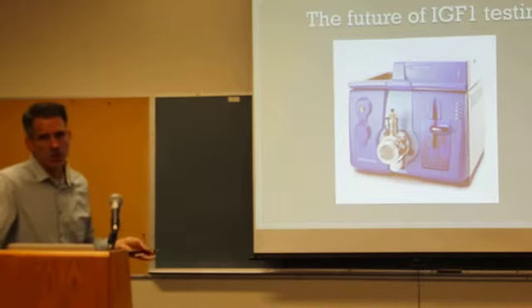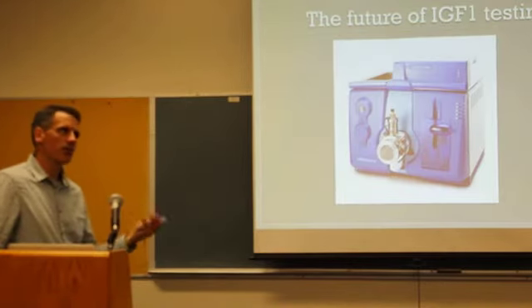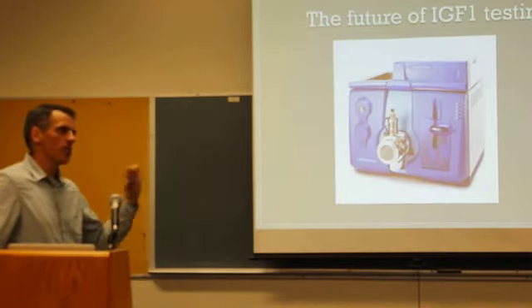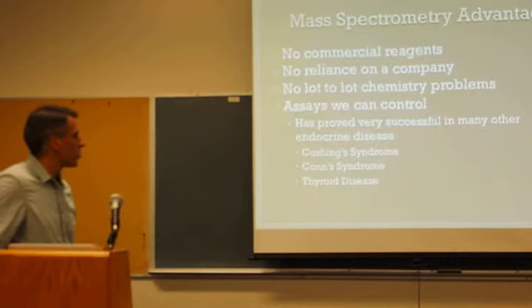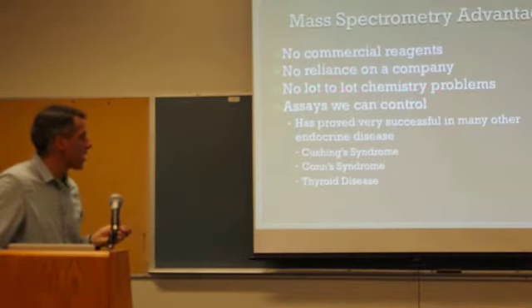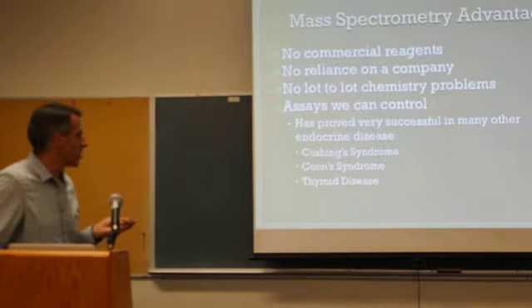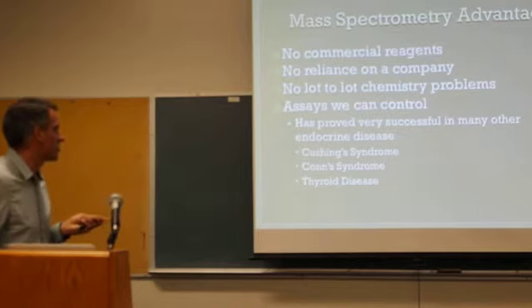The challenge for us in doing an IGF-1 assay is not that hard. The challenge is the normal range. So we need a really good comparison with another big lab that had great normal range data that we could adopt, or we'd have to do our own normal range study. The nice thing about these is there are no commercial reagents, no reliance on the company. We have our own chemistry in-house, so we don't run into lot-to-lot problems, because if we had a bad lot, we just make it again. And companies don't like doing that. If they have a lot that's a little bit close to being outside of spec, they're like, yeah, well, good enough, and cross their fingers, and they do that, actually.